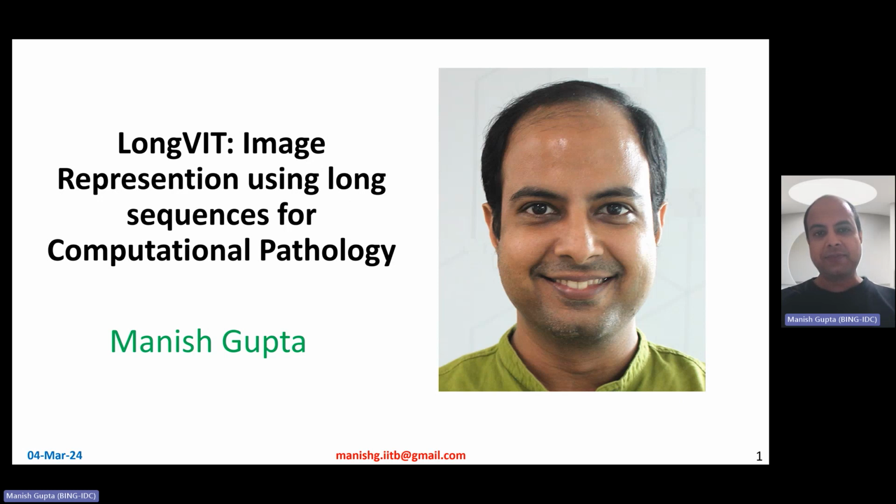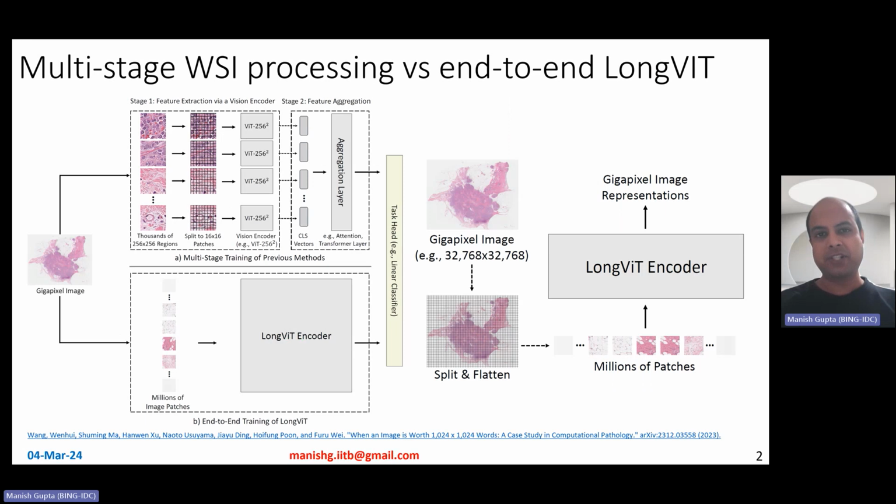Okay, so this is a special kind of model. In fact, the model is generally applicable for other use cases also, but at least in this paper, they sort of focused on computational pathology.